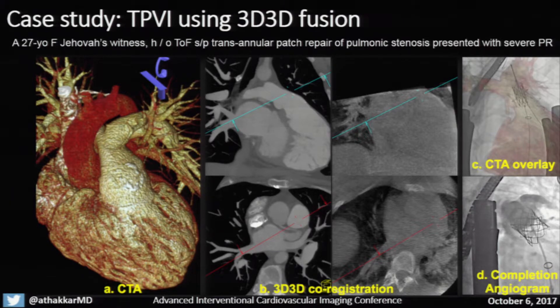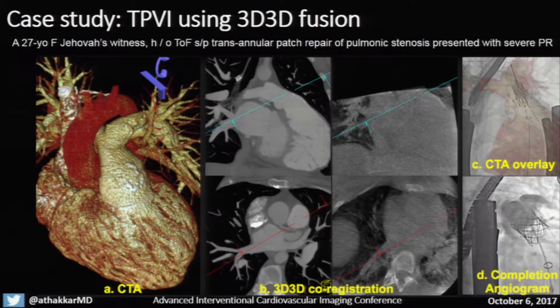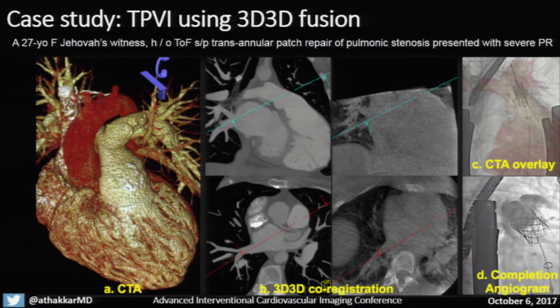Using transcatheter pulmonary valve implantation as a case study: this is a 27-year-old lady with tetralogy of Fallot status post transannular patch repair presenting with pulmonic regurgitation. This panel shows planes from the pre-procedural CT angiogram — our first data set — and this case was performed using 3D-3D fusion for guidance. This panel shows the intermediate cone beam CT images, and you can see the differences in image quality between the two data sets. With the 3D-3D route, the CT angiogram is fused with the on-table cone beam CT, allowing overlay of the 3D volume onto live 2D fluoroscopy.